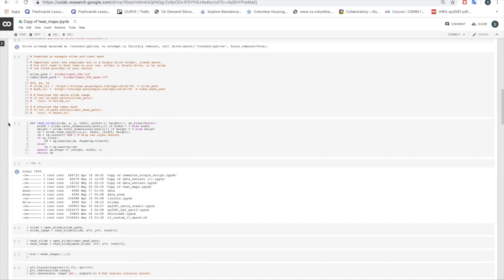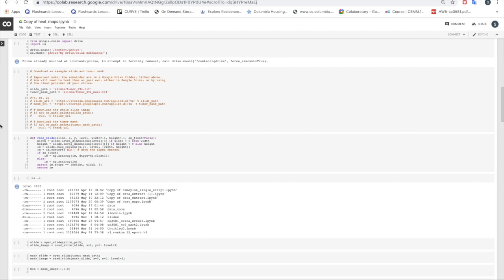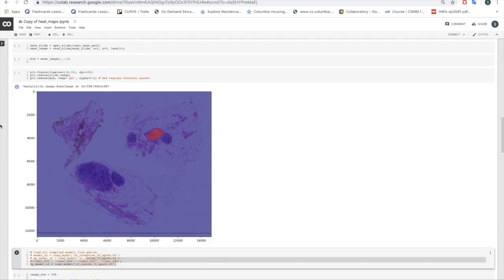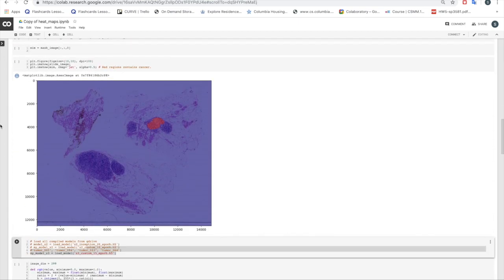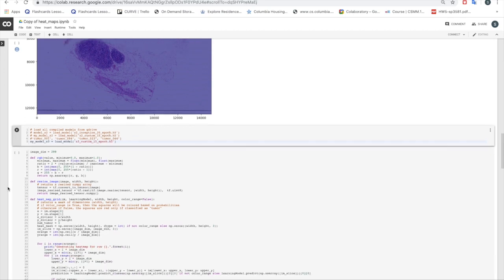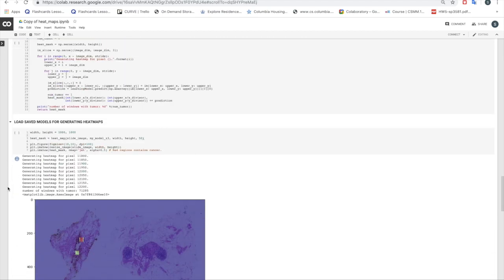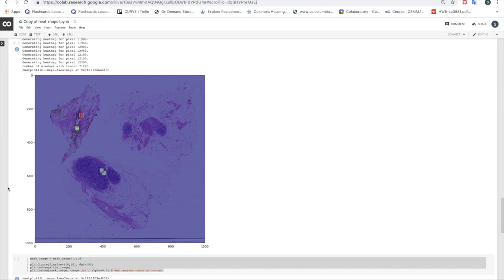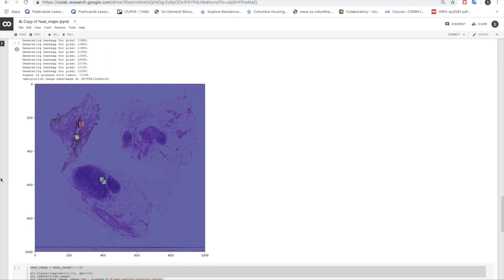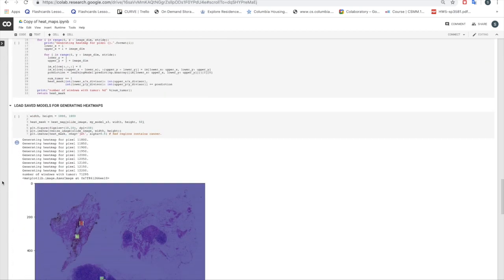So basically we used tumor 94, which is allocated in the test, and this is the expected tissue and the tumor mask, and this is at zoom level 3, so we loaded model zoom level 3 for custom, and we predicted this outcome. As you can see, the location of tumor predicted is not quite accurate.